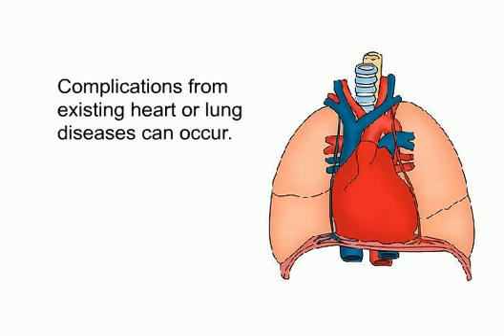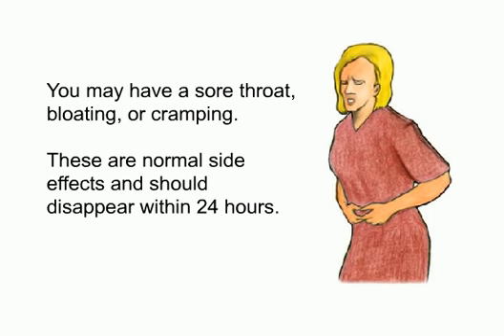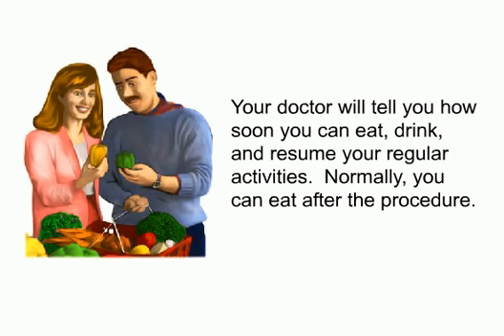Complications from existing heart or lung diseases can occur. Though you will feel stronger as you go home, you should plan on resting for the remainder of the day. You may have a sore throat, bloating, or cramping. These are normal side effects and should disappear within 24 hours. Your doctor will tell you how soon you can eat, drink, and resume your regular activities. Normally, you can eat after the procedure.